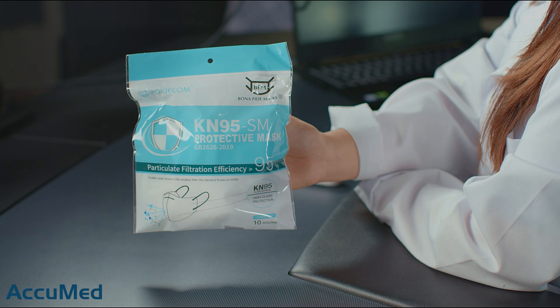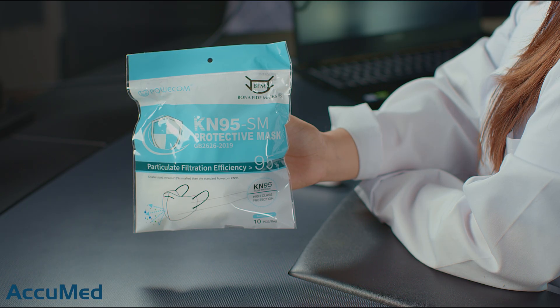Hello everyone and welcome back to the Acumet channel. Today we're going to be reviewing the children's size Palcom KN95. According to the listing, these are made with the new GB2626-2019 standard that should provide better breathability. We're going to be testing that out today with our TSI machine.